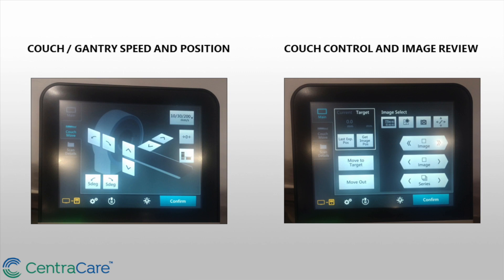The next category is Main, which you'll be using for most of the procedure. It's broadly divided into three parts. The first is the target — you set the target based on your initial pre-procedure scan by dialing in the couch position. Once that's set, you use 'Move to Target' and 'Move Out' to move the couch in and out. When you hit 'Move to Target,' the couch automatically goes and stops at the target, so you don't have to push or pull the couch manually.